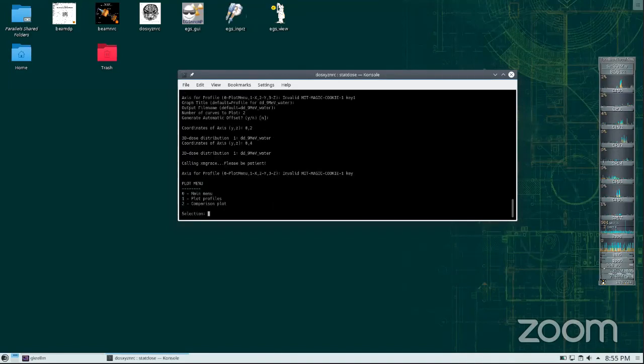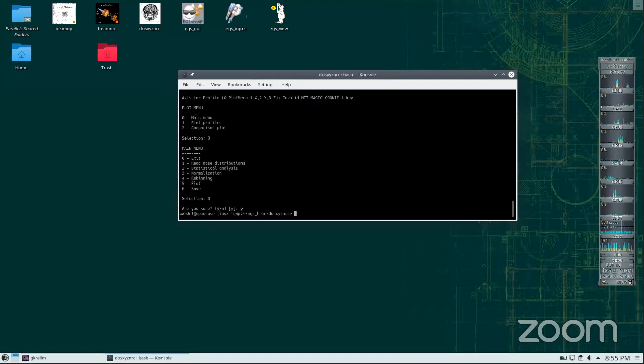So, are there any questions? Because now we're just approaching 2 hours. There is no preview XYZ window, okay? Unfortunately, maybe there is, but I don't think there is.